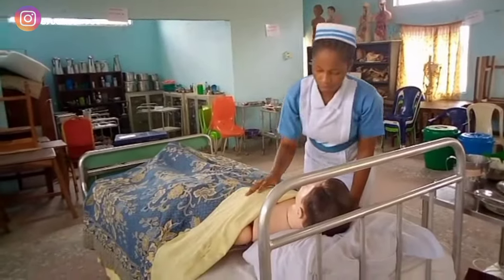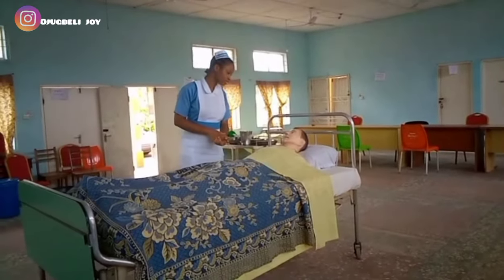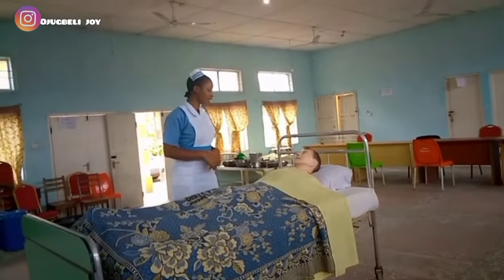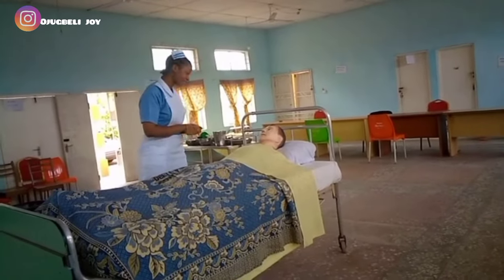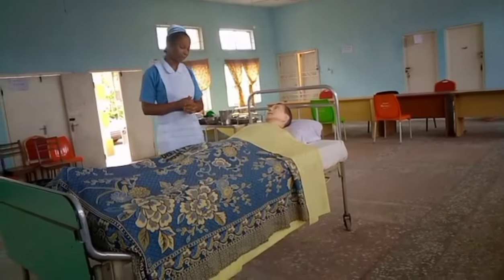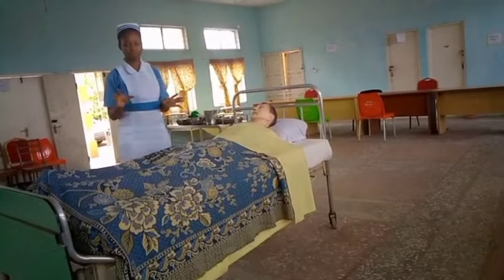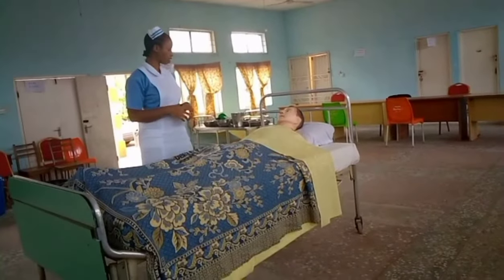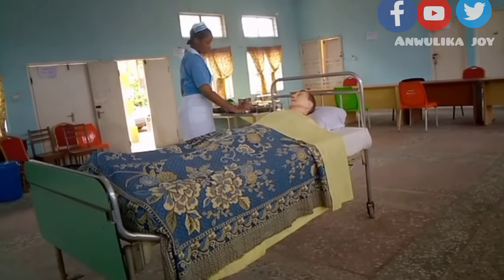For the procedure proper, we have to explain the procedure to the patient, introduce ourselves, get informed consent from the patient, and make sure the patient understands what we are about to carry out. The second thing we will do is to ensure privacy. Then we take the trolley to the patient's bedside.